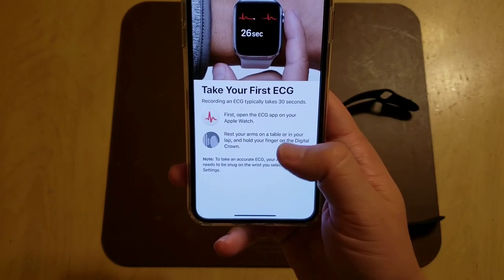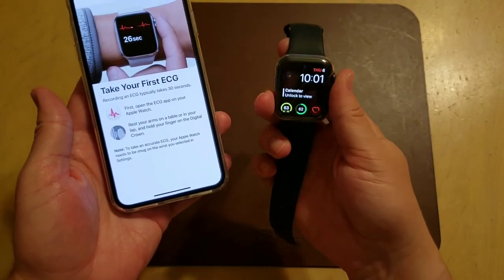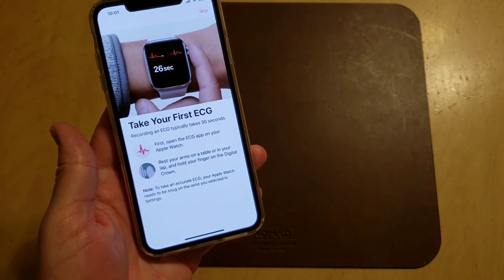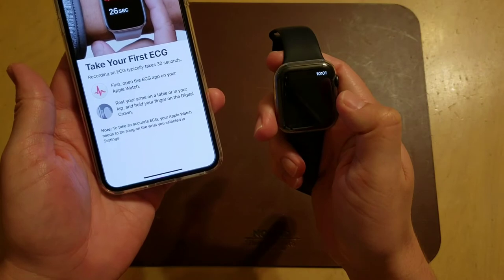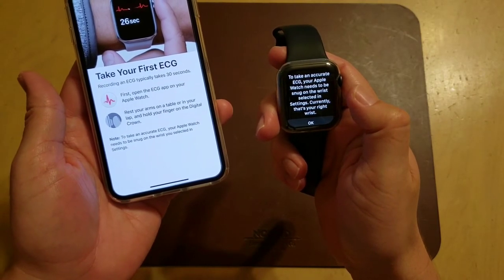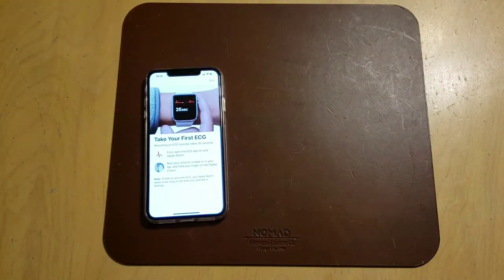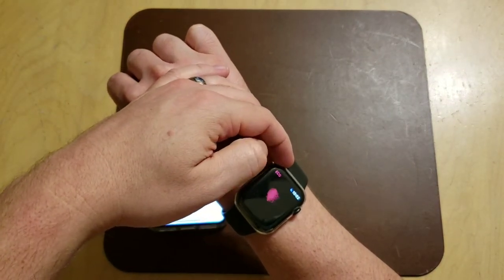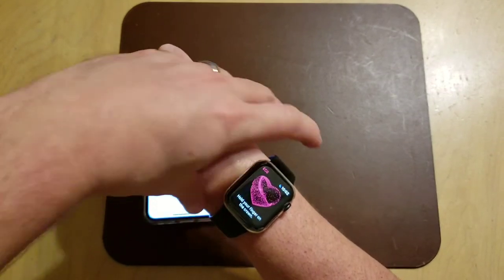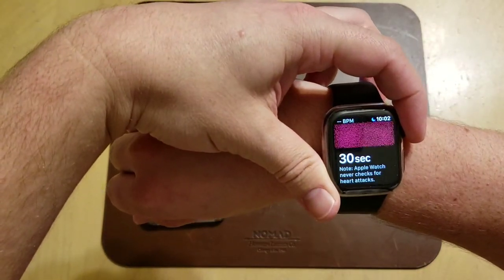Recording an ECG typically takes 30 seconds. First, open the ECG app on the watch. Your Apple Watch needs to be snug on the wrist — select your wrist in Settings. Click OK. Now that it's set up on the watch, hold your finger on the crown. Time to do an ECG — 30 seconds.